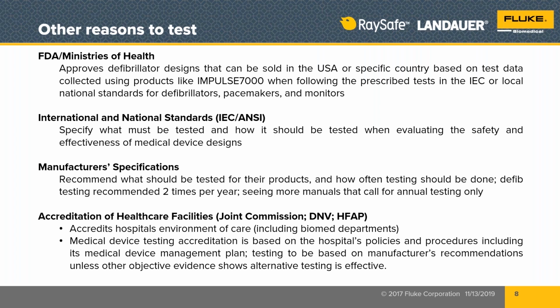So Zoll has theirs, Stryker now, used to be Physio Control, has theirs, Cardiac Science has theirs, and on and on. So when we're doing testing as biomedical engineers and technicians, we need to be following the manufacturer's service manual procedure in that test, not our own made up one, the one that the manufacturer has created, using the requirements in the standards and adjusting them to match their design of their brand and model of defibrillator.